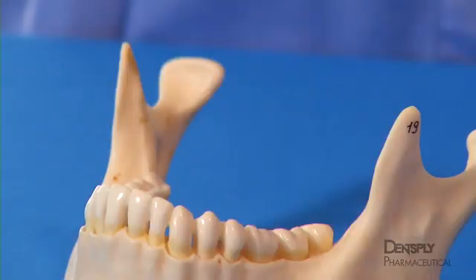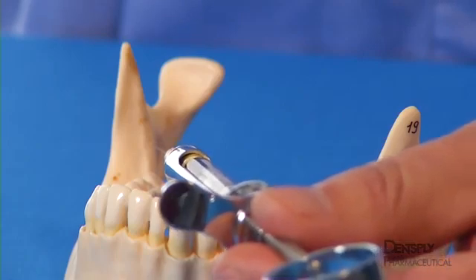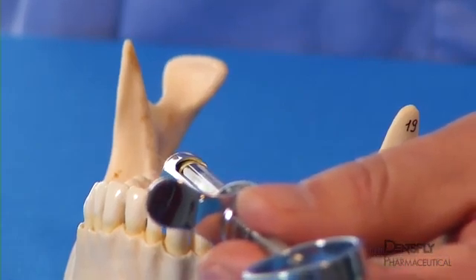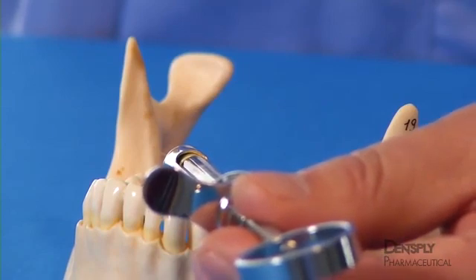Two reasons commonly account for failure to encounter bone at the proper insertion depth. First, the clinician may have positioned the syringe improperly within the plane of insertion. If the angle is too great or the insertion point too lateral, bone will be hit prematurely.